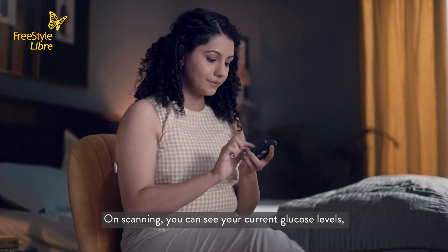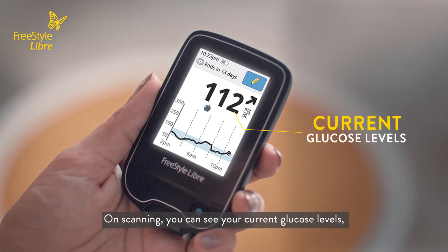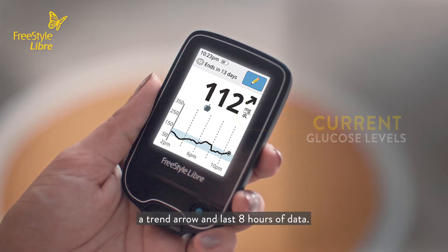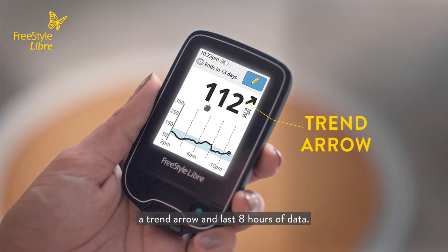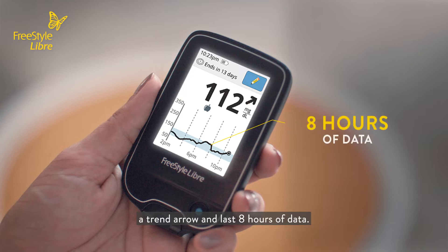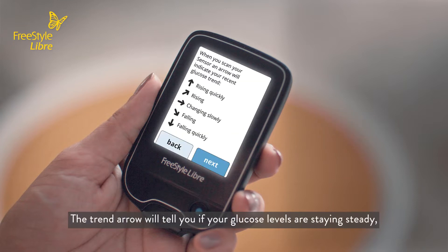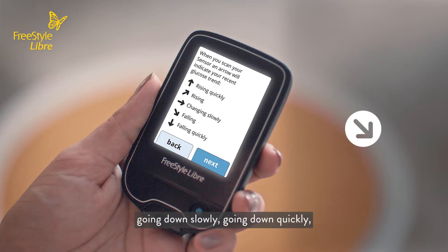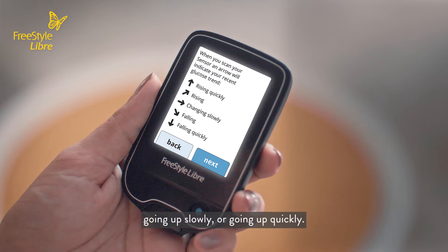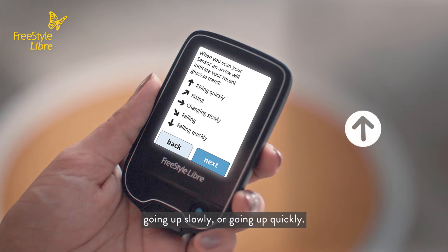On scanning, you can see your current glucose levels, a trend arrow, and the last eight hours of data. The trend arrow will tell you if your glucose levels are staying steady, going down slowly, going down quickly, going up slowly, or going up quickly.